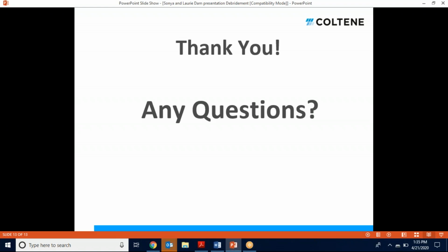One comment that I wrote down, talking about what Pete just said, is the difference between the K-file, reamers, and H-files. We hear those so often in the field, but we're really only dealing with K-files along with our rotary files. Just to keep them straight: K-files are for scouting the canal.